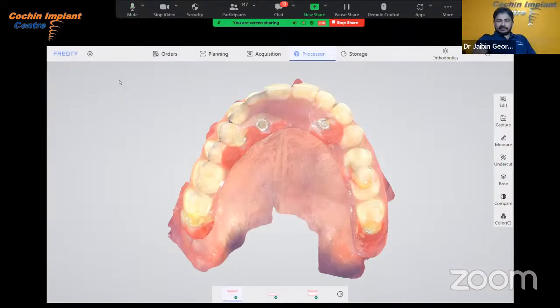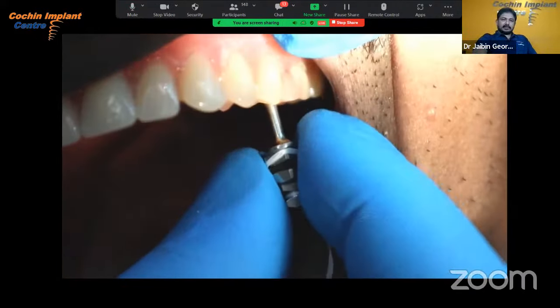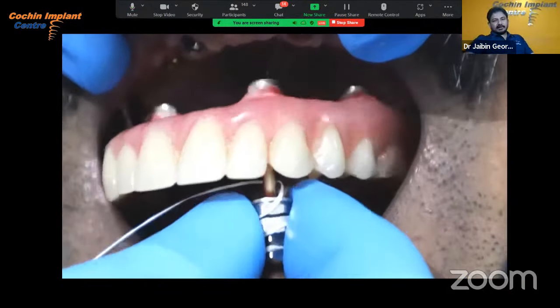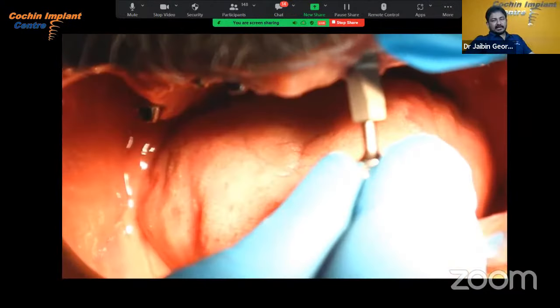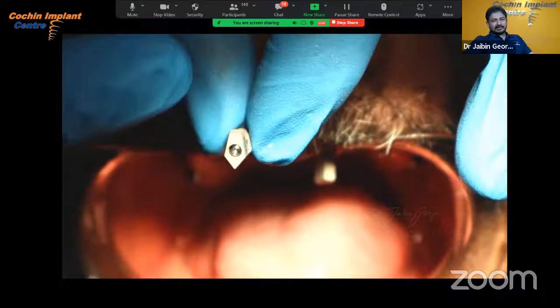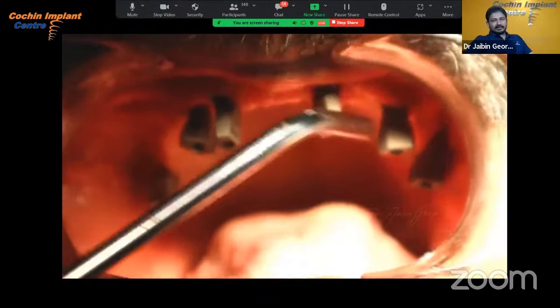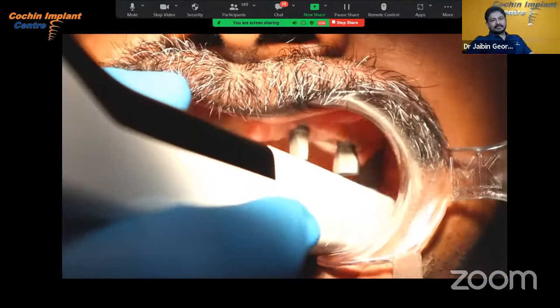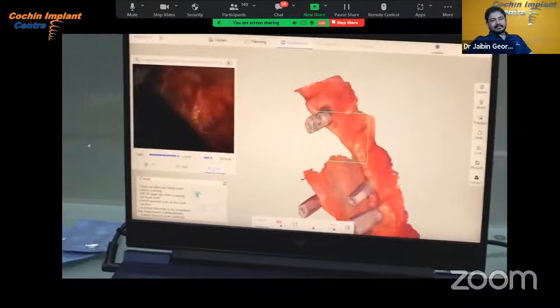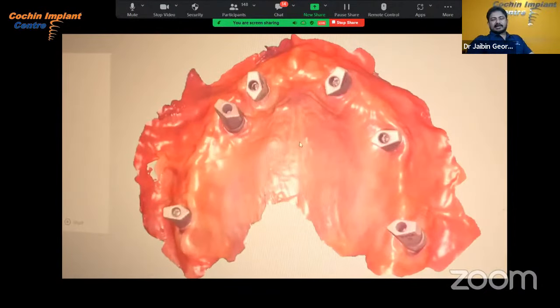This is the intraoral scan of the denture. Then we remove the temporary prosthesis, and you can see the screw retained temporary prosthesis is removed, and the multi-unit abutment scan body. Scan bodies are attached to the multi-unit abutments. Scan is made. So the scanning part is over.